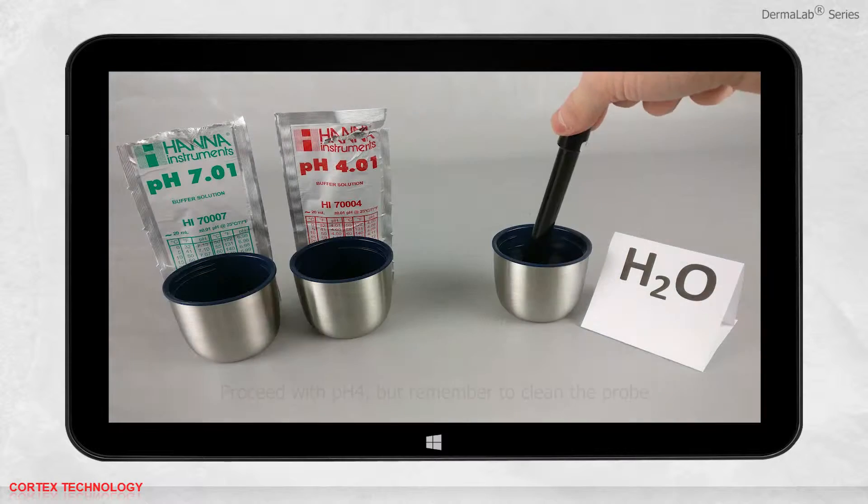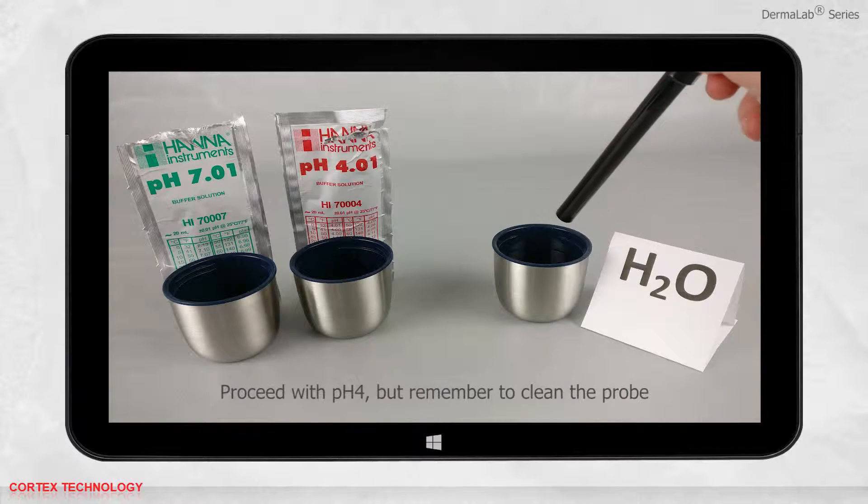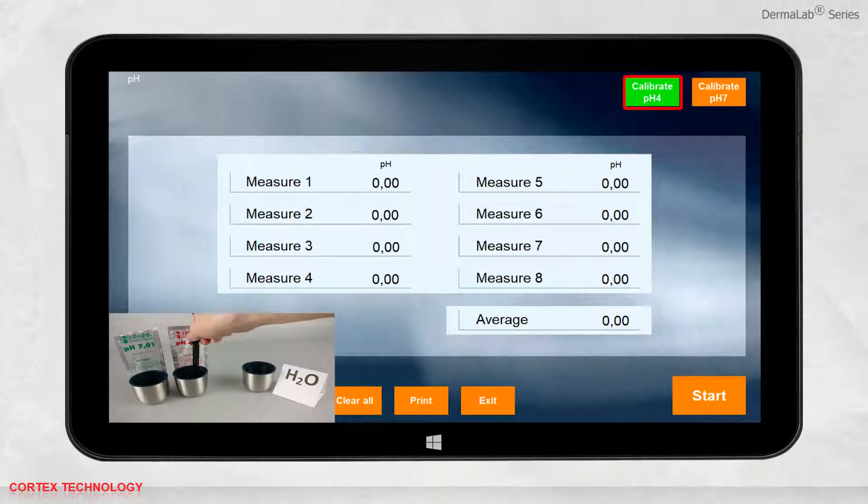You can now proceed to the pH 4 calibration. Remember to clean the probe first. Put the probe in the pH 4 solution and hold it until the calibration is complete.